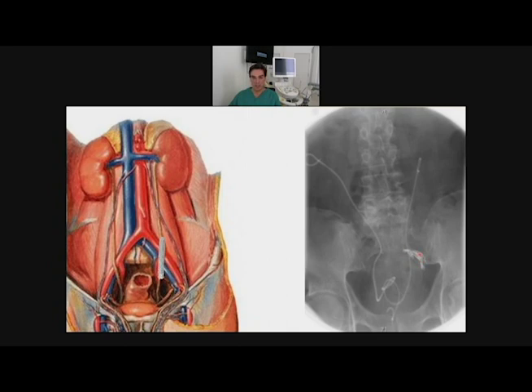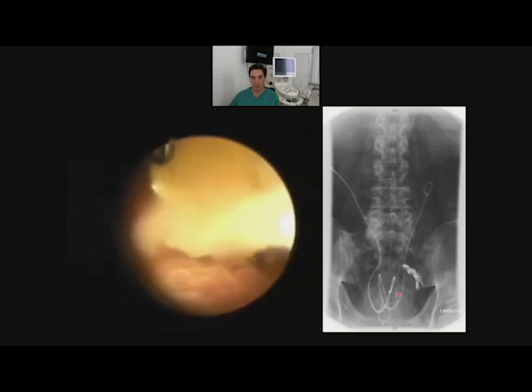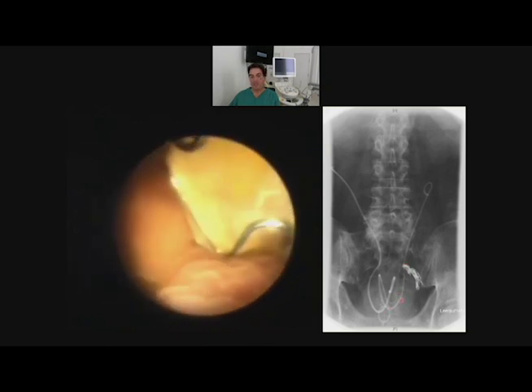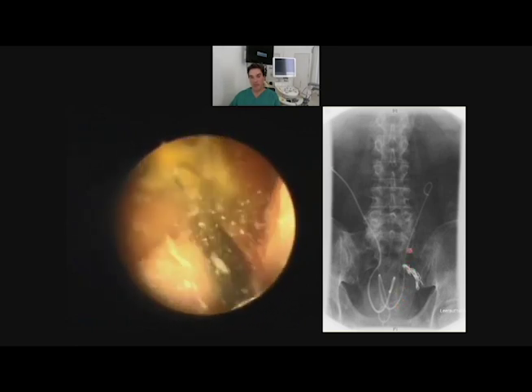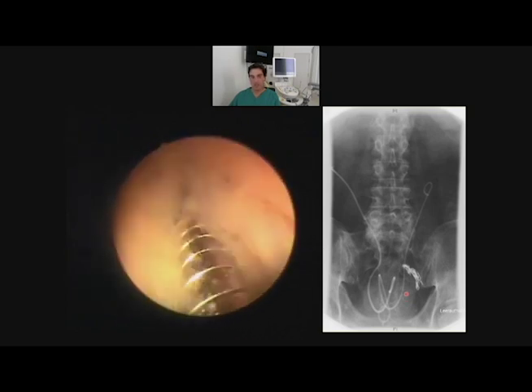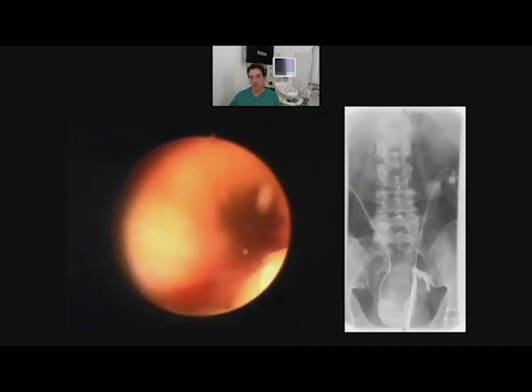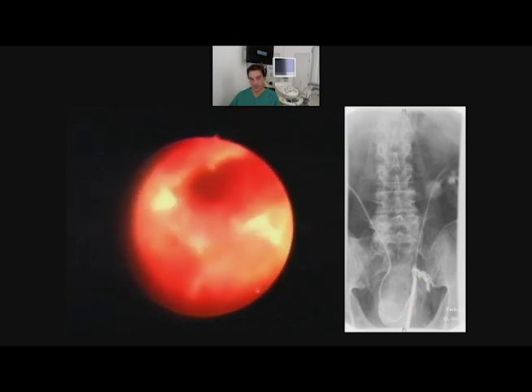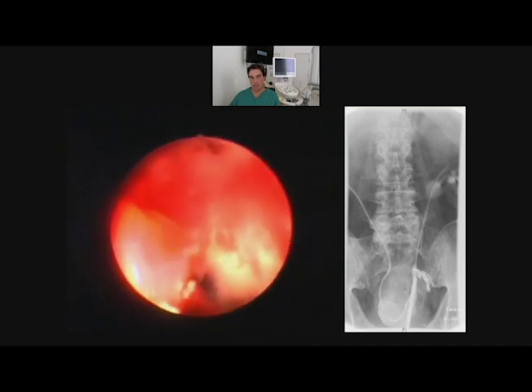Here you see it, this is a coiling, you see here the stenosis part. What we do now, we put a stent inside, and all is closed. This stent is dislocated. It is not completely covering it now because it came down a little deeper after 8 months. Interesting is, that's why I show it to you, I go now inside that part where the iliac was inside before. And I want to show you that the bridging is working very well.